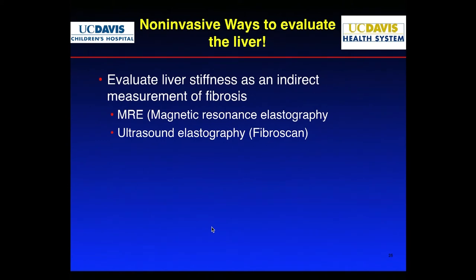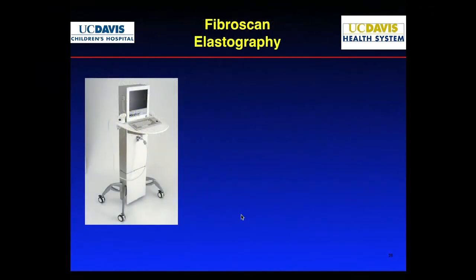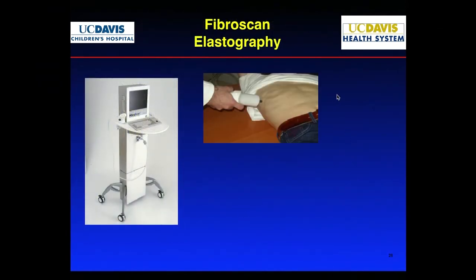So especially for, there's a new technology of using magnetic resonance elastography. Now we don't have that in our institution, but I know that there's some available in some places now. What we've been using is the FibroScan, which is using ultrasound elastography. And I won't go through all the systems here, but this is what it is. In fact, we are able to get this as part of research grants. So we don't charge patients for this. We just do this as part of a study.